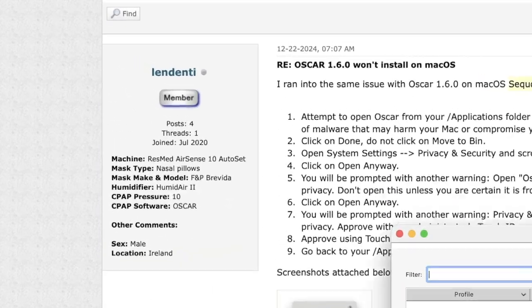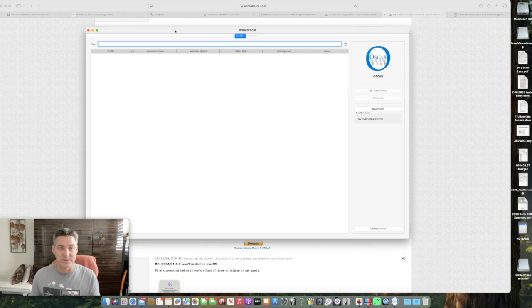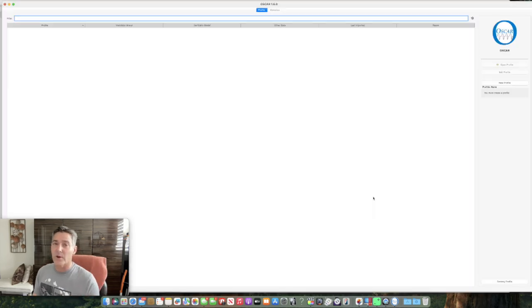You solved this old Papper guy's life, I was getting really frustrated. Now let's go ahead and get into how to open up Oscar, how to use it.